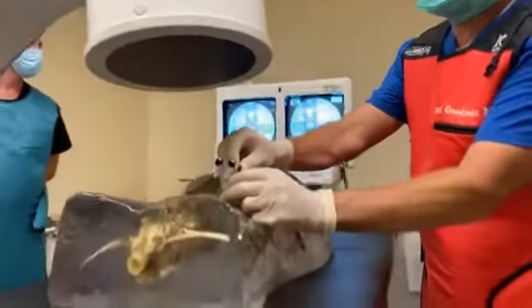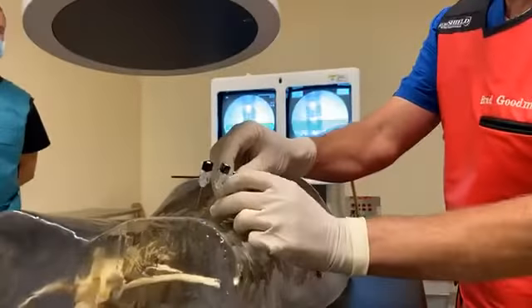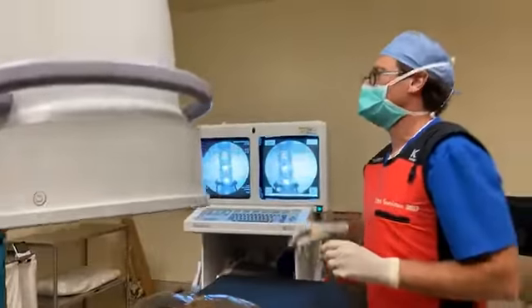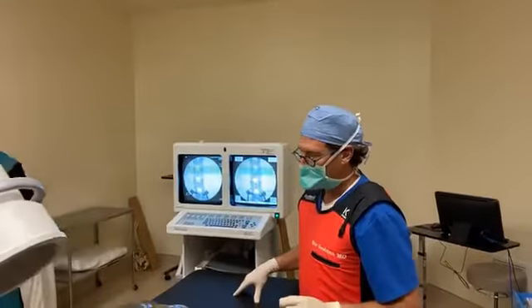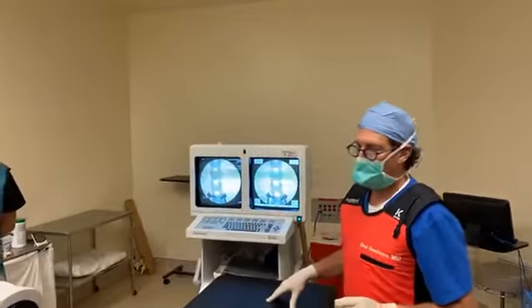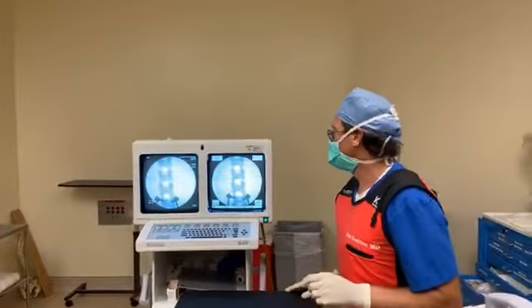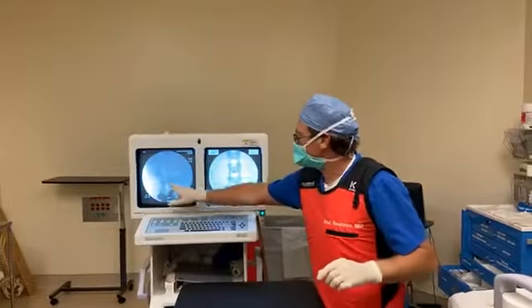This is where we want to be. Good. Save that, put it on the right, let's check a lateral again. Any questions there, Seth? Not yet. Okay. So we're good. Okay, so this is really as deep as we want to go.